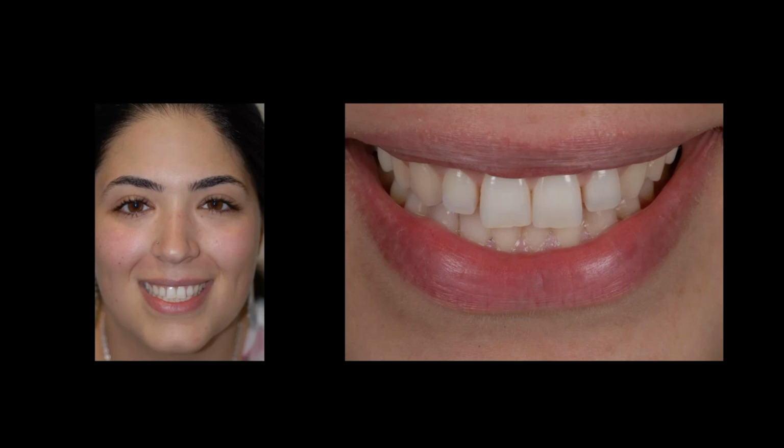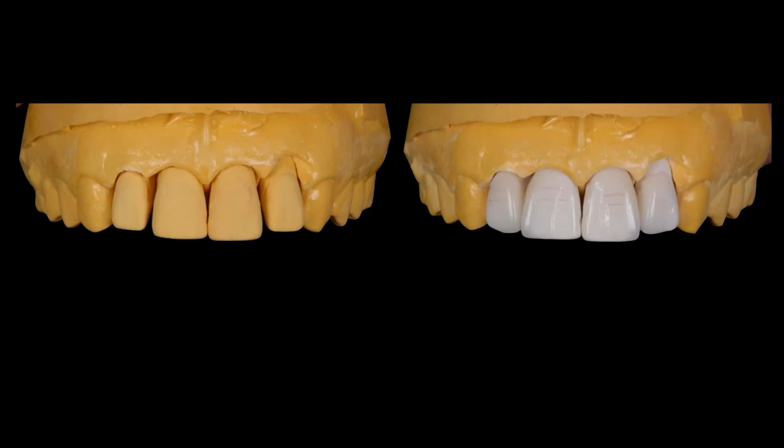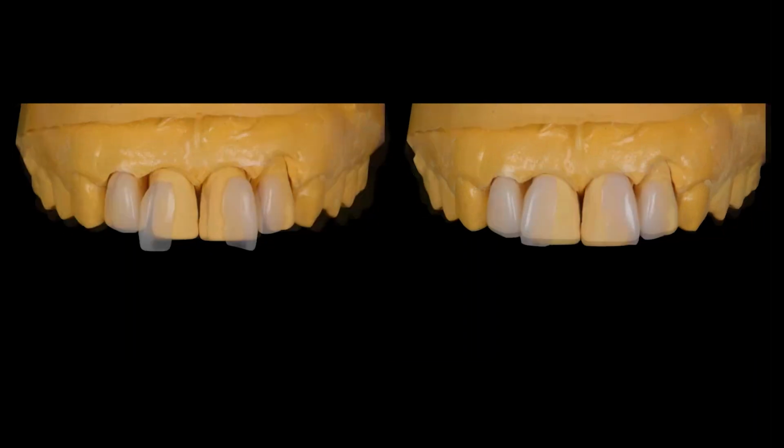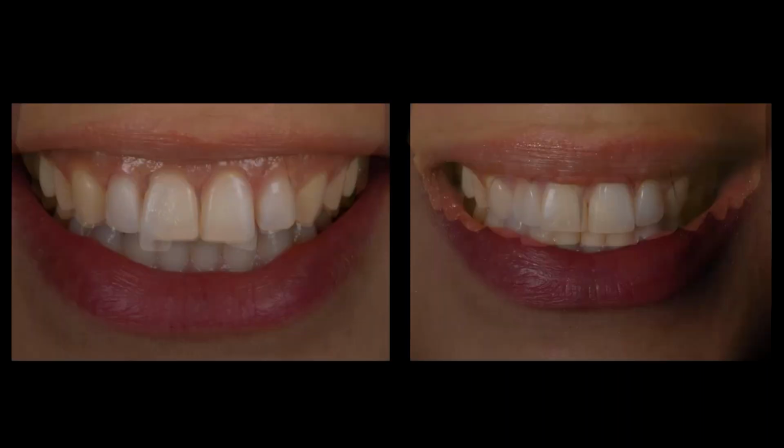She's also not the tallest person, and there were these little spaces and embrasures that kind of made them look like childlike teeth. So we fixed those by just changing some basics. The basics were, we're going to shorten the teeth by enamelplasty. We're not going to grind on the teeth because they're healthy, nice teeth. And then we're just going to place some little window veneers to fill the spaces. So we leveled off the plane with a very slight enamelplasty, a few window veneers to fill the space. And then we can change that concept of how she feels.